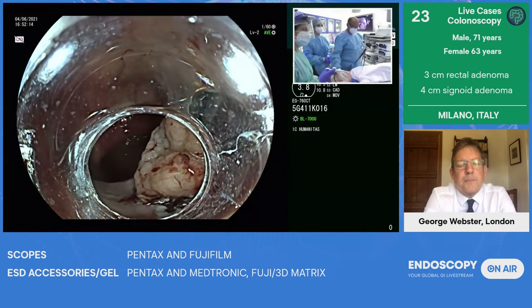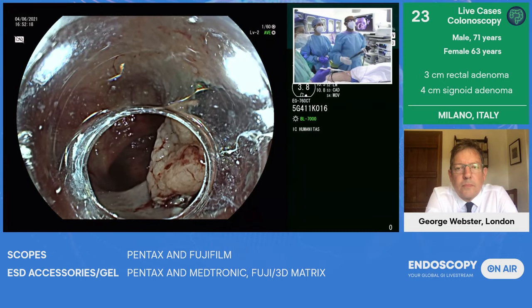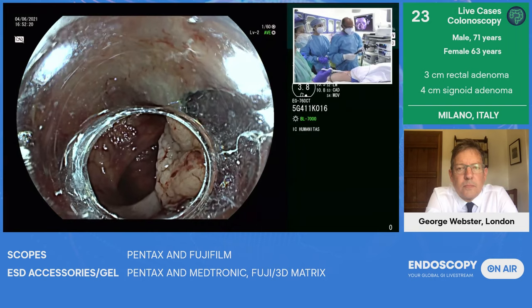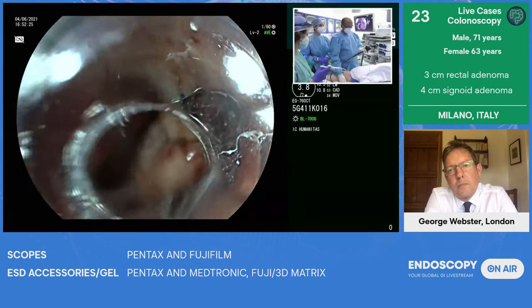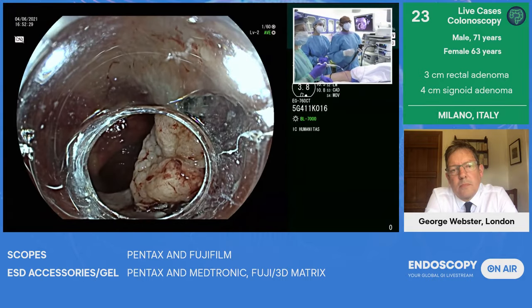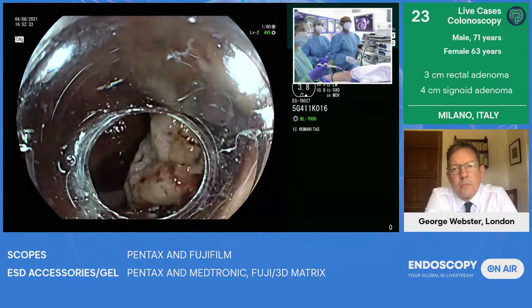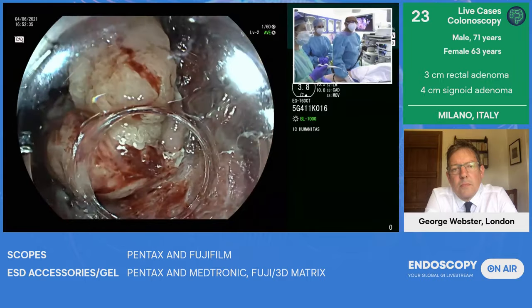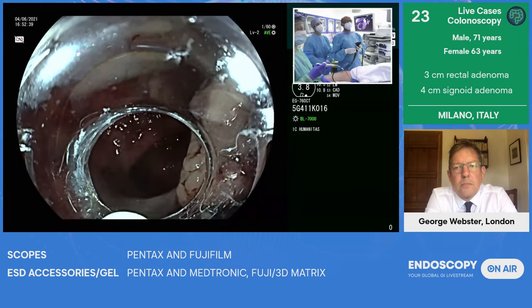First, I'm using a Fujifilm EG760 CT gastroscope because in the rectum, a gastroscope allows more flexibility. This has a 3.8 millimeter channel, so it allows a lot of suction, so we can save time. I'm using a Fuji hood, which allows me to get under these lesions very well. And I'll be using a new knife from Medtronic called the Switch Knife.